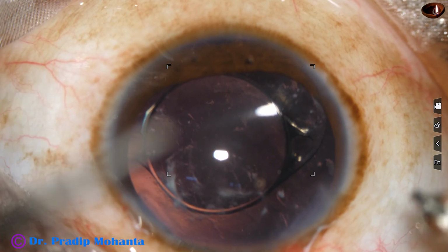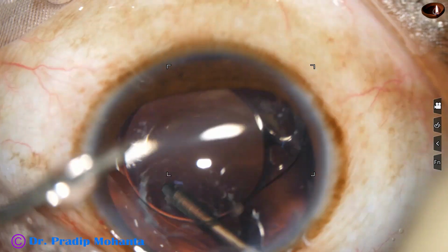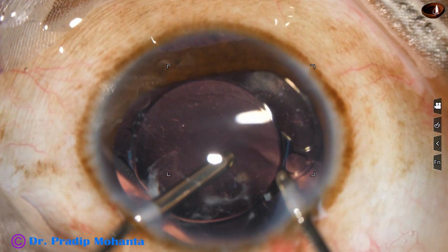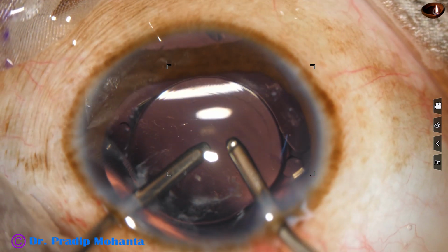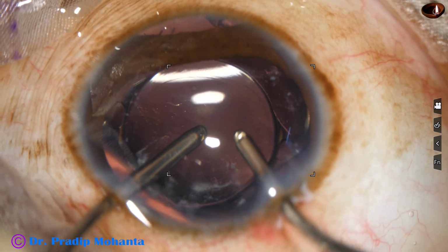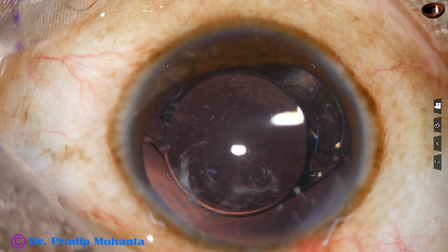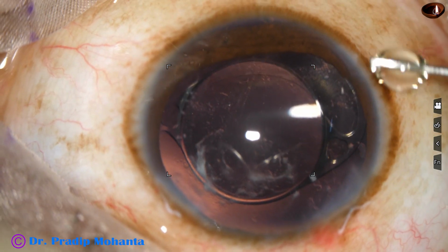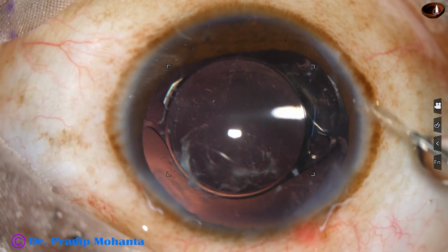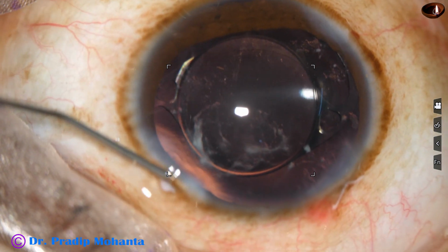So in this case, what I want to emphasize is that whenever there is history of trauma, use of pre-chopper is a good idea because the zonule may be weak, some zonular fibers may be torn, the nucleus may resist to rotate, and if we use phaco needle to chop, there is lot of irrigation pressure of fluid, the bag is stressed too much and zonular fibers are really stressed. So whenever there is weak zonule, we can think of using a pre-chopper.